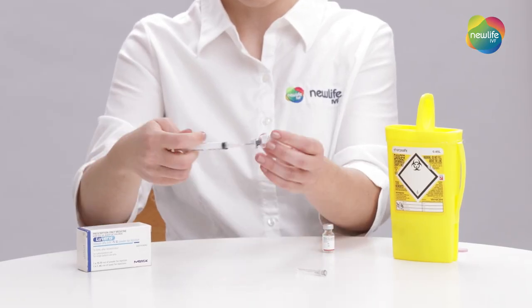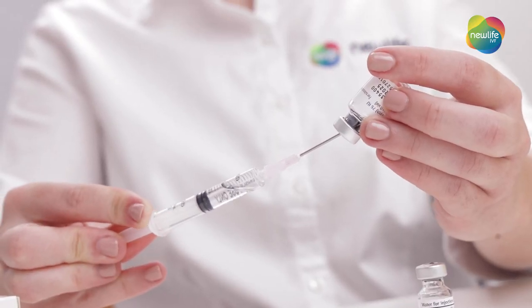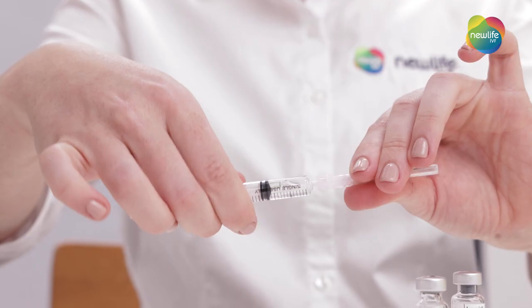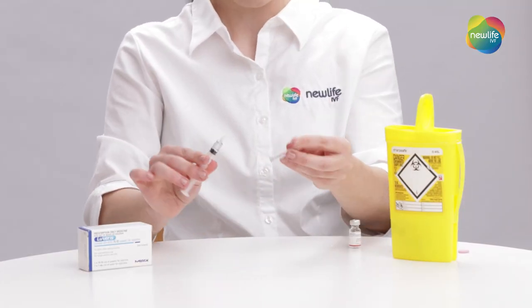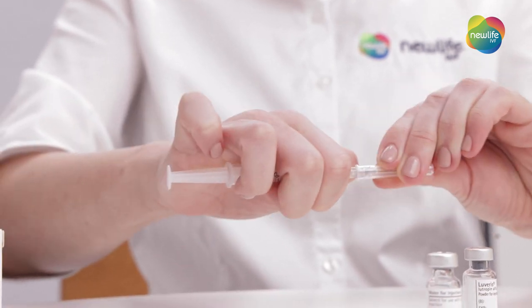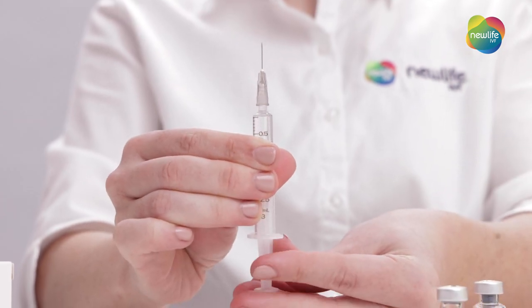Pull the end of the plunger down to draw the water back into the syringe. Place the needle cap onto the needle and remove the needle. Now attach the smaller fine administering needle. Remove your cap and again push out any excess air you may have in the syringe. You're now ready to inject.